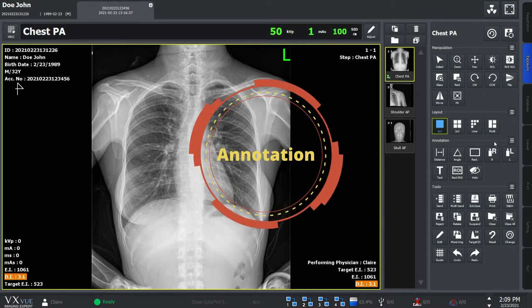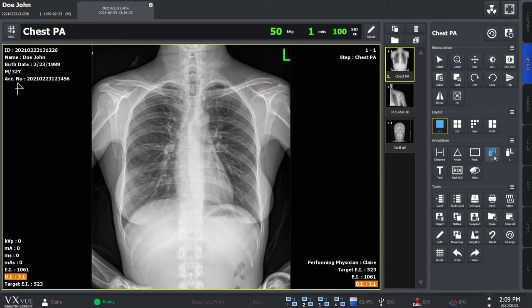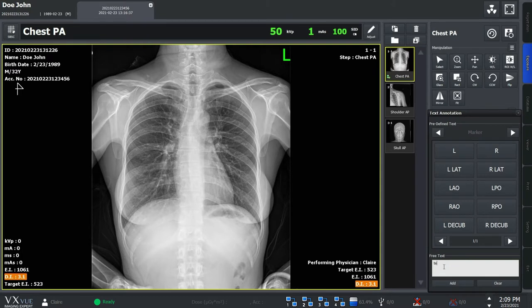Probably the most frequently used annotations are right and left. If a step needs a specific annotation every time, you can make it to be added automatically by using options in Procedure Manager. You can also type in your own annotations here.